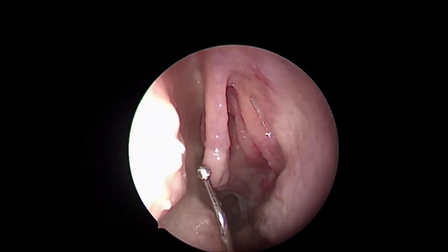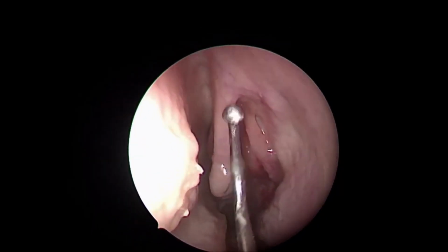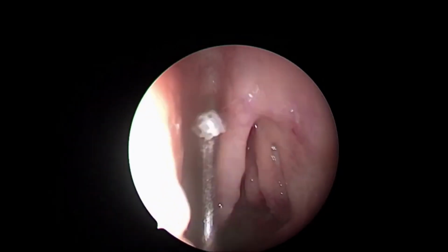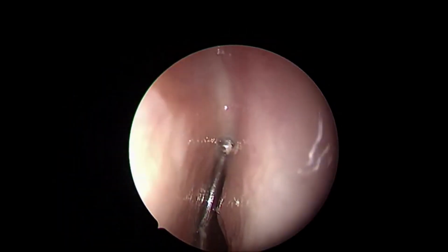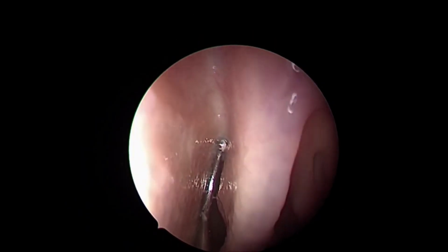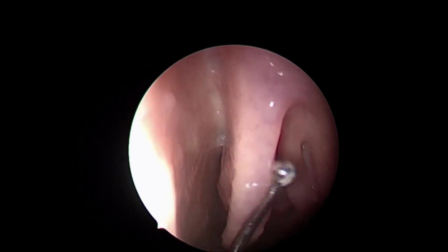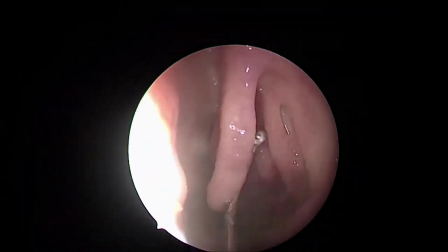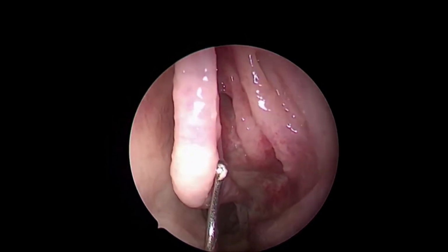So this is the middle turbinate. As I mentioned, it has three parts. The anterior-most part lying in the sagittal plane, going up anteriorly, inserting onto the frontonasal process, and the posterior part going high up to insert onto the cribriform plate, a very important area at the junction of horizontal and lateral lamella. That's why this turbinate has to be gently handled as you go up towards the cribriform, so as not to damage the cribriform and get a distant CSF leak. So this is the first important part lying in the sagittal plane.